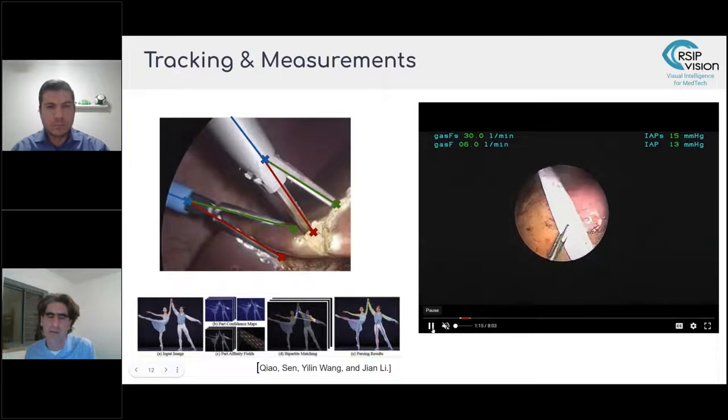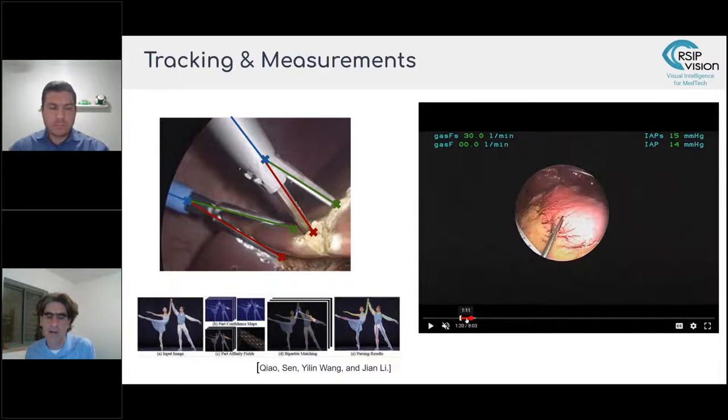This is the way surgical measurements are done today. This is a surgical ruler, and it's introduced in the scene. It's sort of hard to see, it's not very precise, and it's a manual and physical process. Now, having these tools in the scene with a known structure is really introducing a kind of ruler into the surgical scene. Using it manually is difficult. It's much easier with our own eyes to see numbers on a ruler and to perform the measurement.